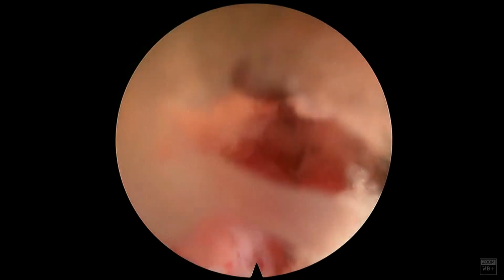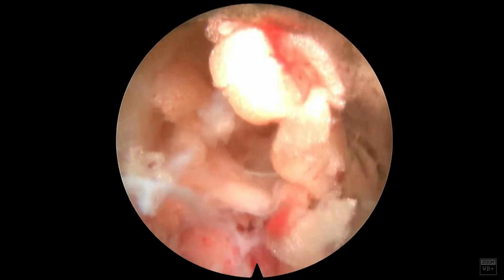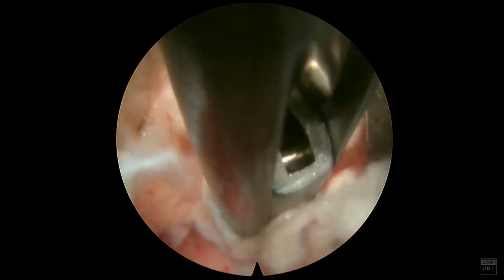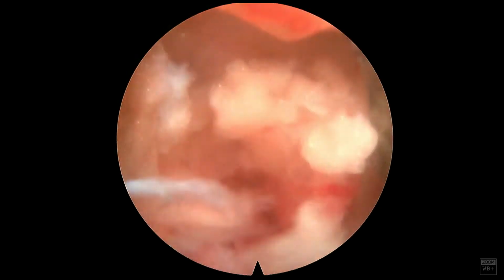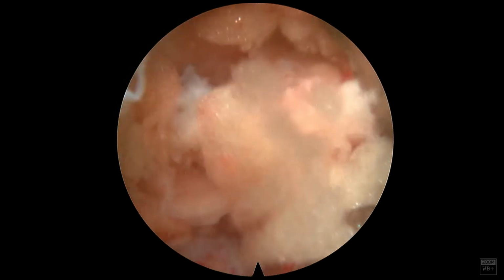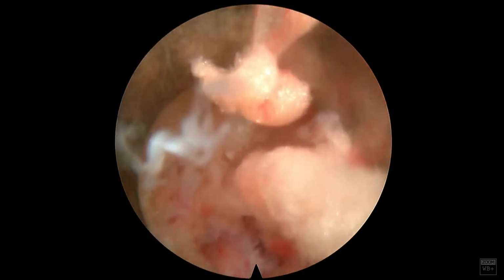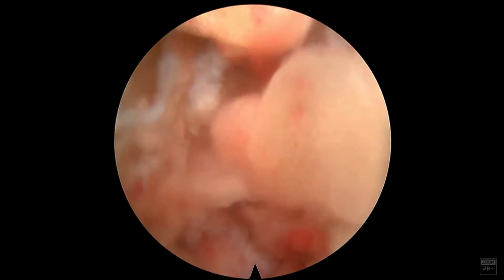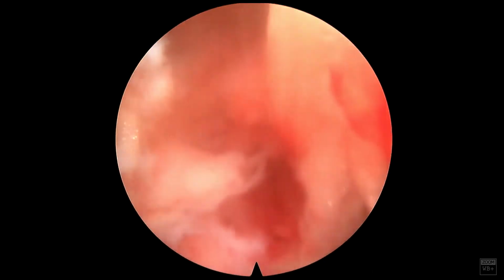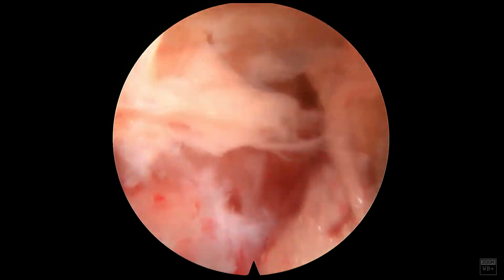And so here in the bottom corner, you can see this is where the case gets interesting. This patient ended up having a calcified disc herniation. I don't typically get CT scans on lumbar cases. It's probably a good rule of thumb, if the patient has had radicular symptoms for even more than a year or close to a year, to get CT scans. I'm pretty comfortable that once I get in there, it's not really going to change my treatment. I'm going to either shave down the calcified disc and open up the foramen.